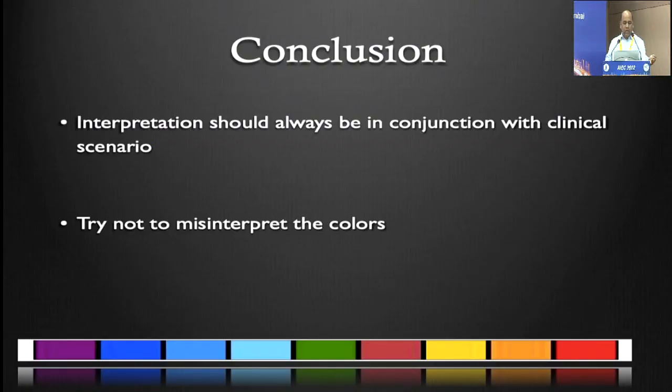So in conclusion, interpretation should always be in conjunction with the clinical scenario, and we should not try to misinterpret the colors.